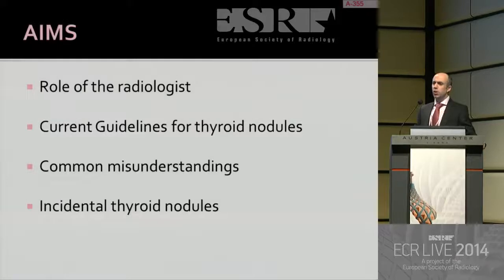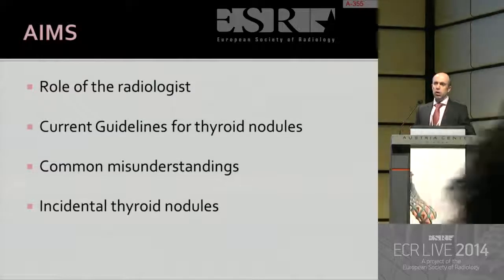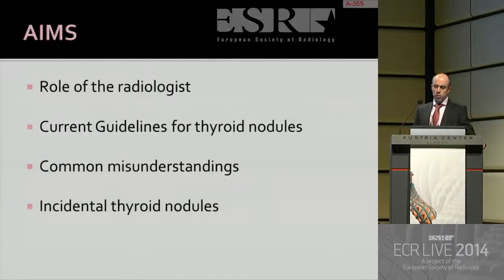So during this talk, I'm going to cover what I consider to be the important aspects regarding the role of the radiologist in thyroid nodule imaging. We'll look at some of the current international guidelines for thyroid nodules. We'll look at differences between some of these guidelines. And then we're going to cover some of what I consider to be the common misunderstandings regarding thyroid nodule ultrasound and management. And then finally, I'll briefly cover the topic of incidental thyroid nodules.